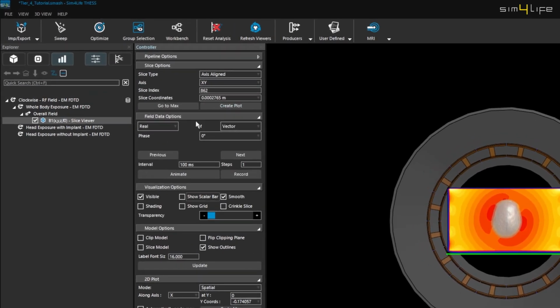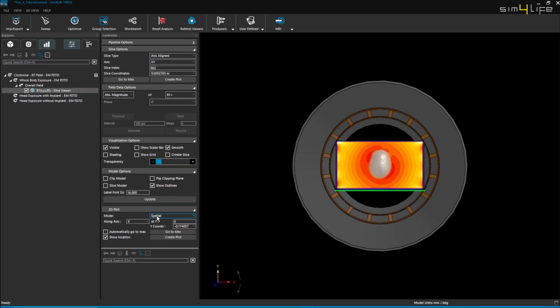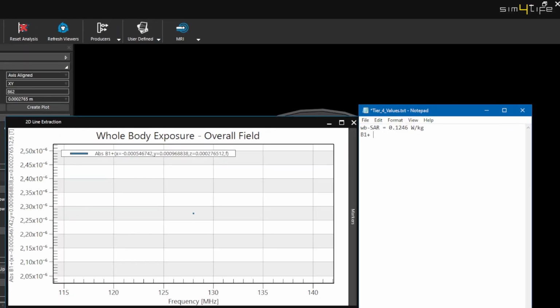In the field Data Options, select Absolute Magnitude of B1+ from the drop-down menu. At the bottom of the controller window, in the 2D plot settings, select Temporal Mode, tick the Show Location box, and navigate through the X and Y coordinates to the isocenter. Finally, hit Plot and note down the value of the B1+ field in Tesla.